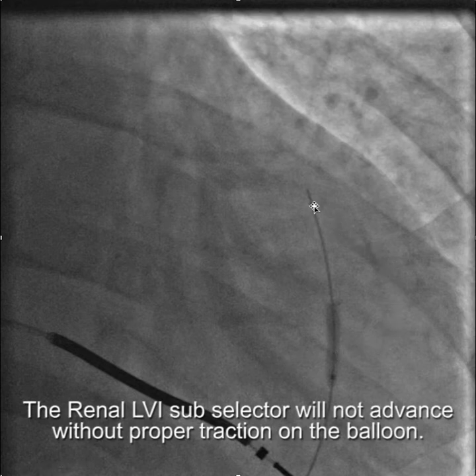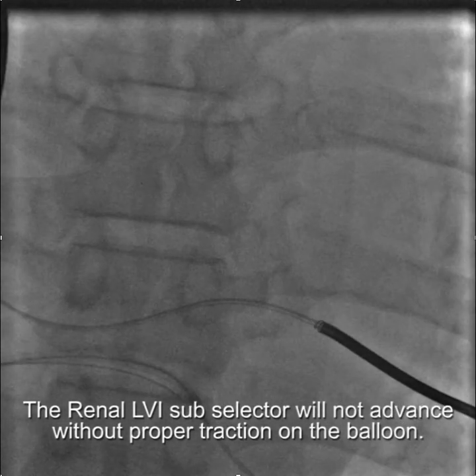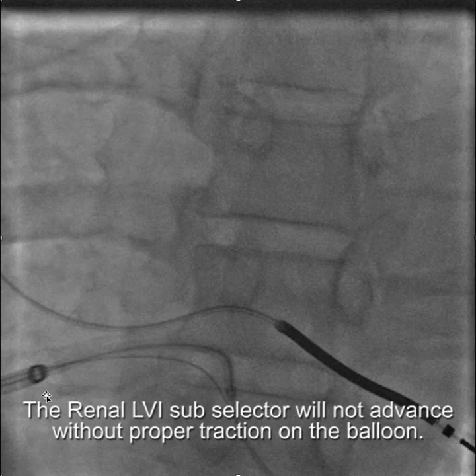And you can see how long this balloon is. And here's the tip marker and here's the tail marker. This just happened to be the only balloon that we could find that went over an .018 wire at the time. Okay, so we had the balloon inflated, and we're trying to advance the renal subselector, but it won't advance. And that's because we're not putting enough traction on the balloon.